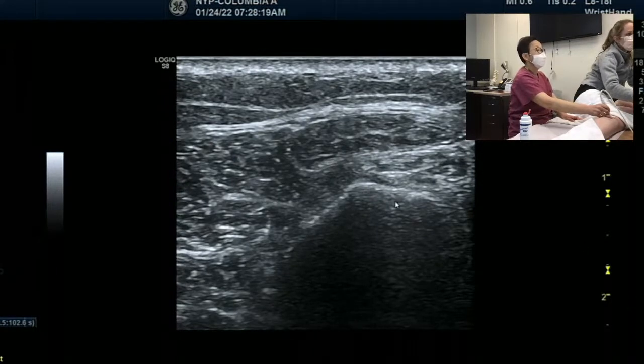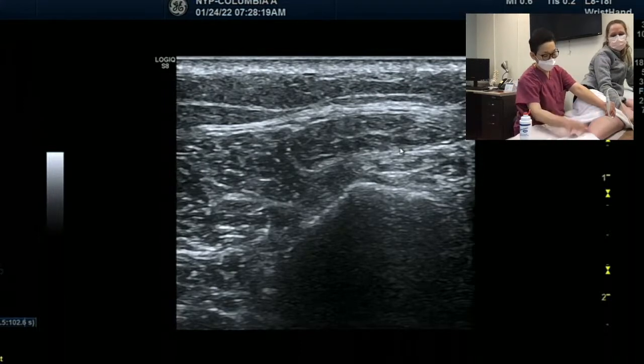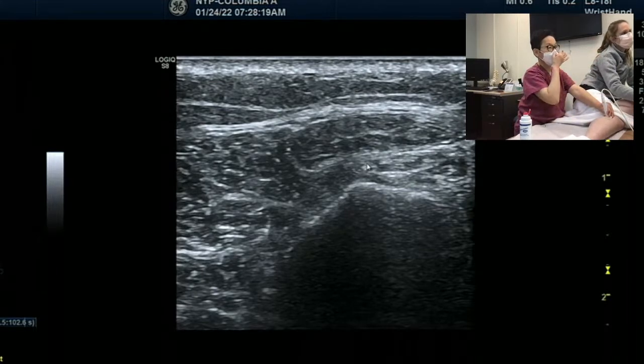So here's the fibular head, here's the peroneus longus. We're starting to see the common peroneal nerve split into the deep and superficial nerves. The one that's closest to the peroneus longus is going to be superficial. This is just underneath the fibula head, the neck. You see two clear nerves, very similar to the sural nerve but simpler. The sural nerve has a lot of dots. This one has two dots.